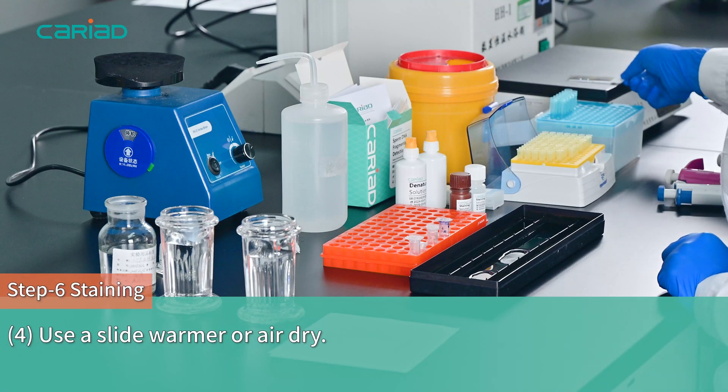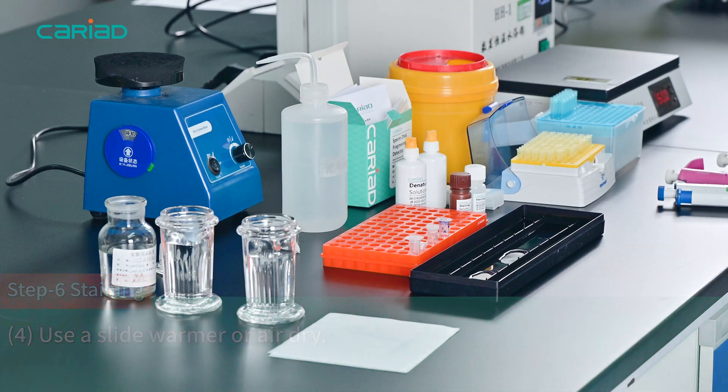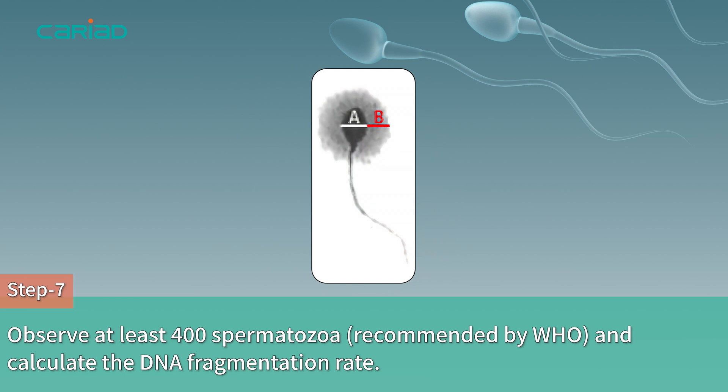Use a slide warmer or air dry. Step 7: Observe at least 400 spermatozoa and calculate the DNA fragmentation rate.